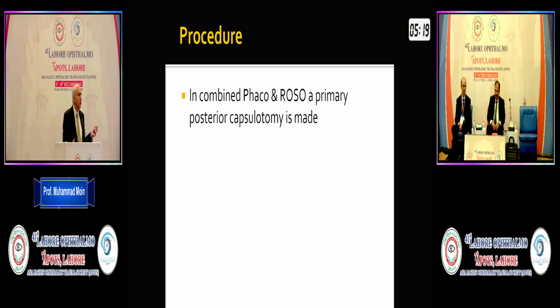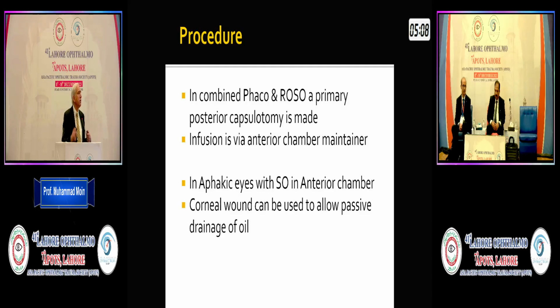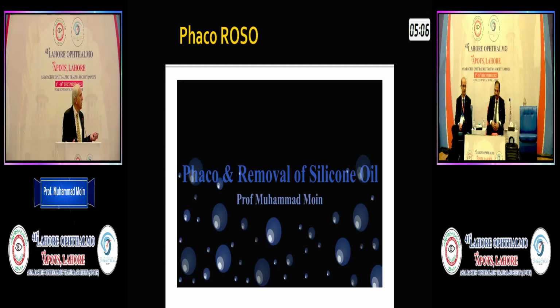So the procedure in combined phaco and silicone oil removal is a primary posterior capsulotomy. An infusion anterior chamber maintainer is used, and in an aphakic eye, silicone oil can be removed just from the anterior chamber. So I'll just go on to the video.